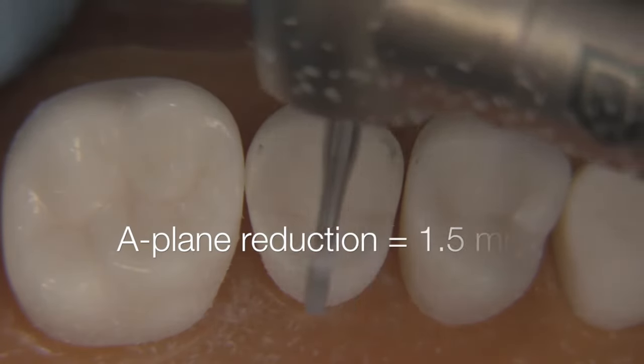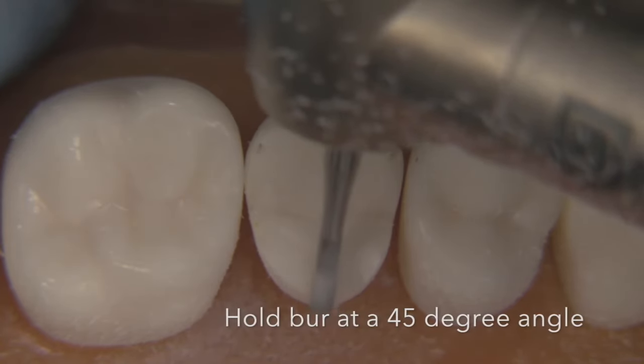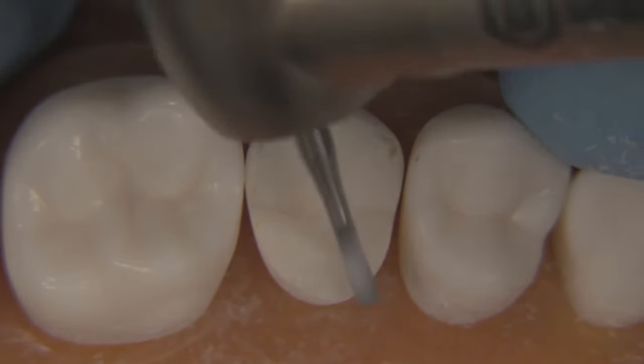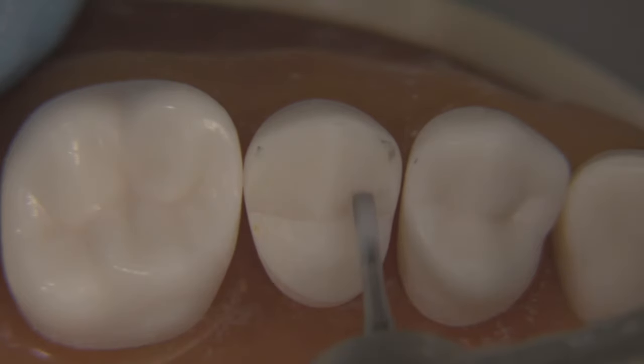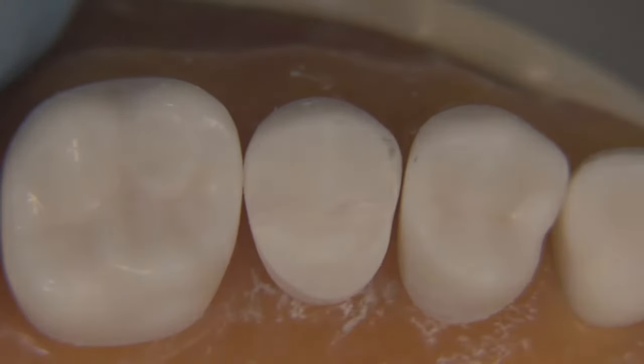We can now turn our attention to the A-plane and we want 1.5 millimeters of occlusal clearance here. Hold the bur at about a 45-degree angle, which lines up quite nicely with the opposing mandibular cusps. This functional bevel is going to be angled about 45 degrees relative to the horizontal. Make sure you don't make it too steep or too flat. Spend some time here — this is probably the most important step in terms of preserving aesthetics: don't over-reduce the facial cusps, yet provide yourself with a very robust restoration in the functional cusp areas.